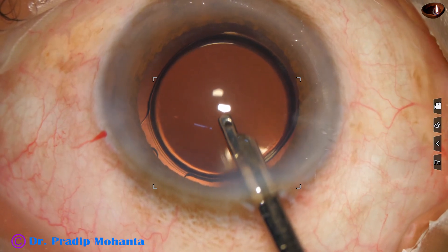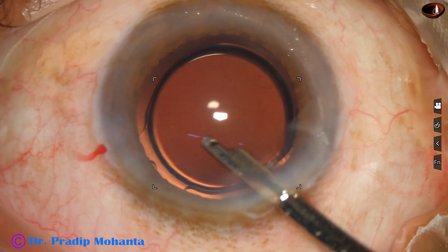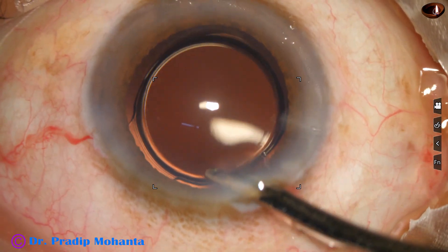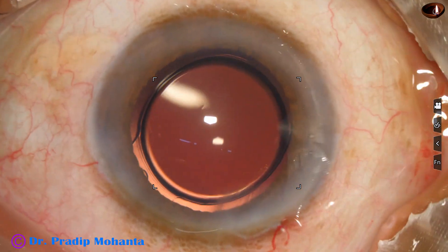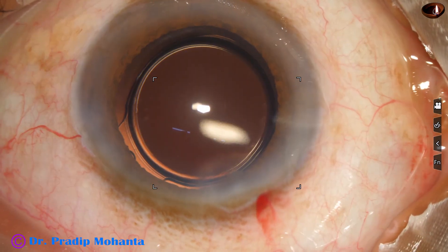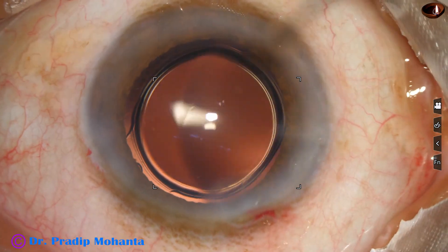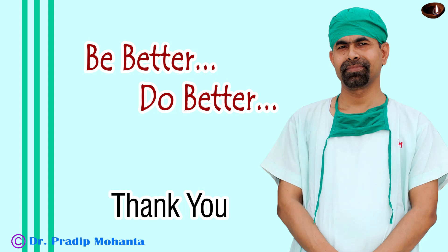This is the lavage and the chamber is nicely formed by Simcoe. Integrity is maintained. Such a drop of moxifloxacin is applied over the ocular surface. The surgery is concluded.